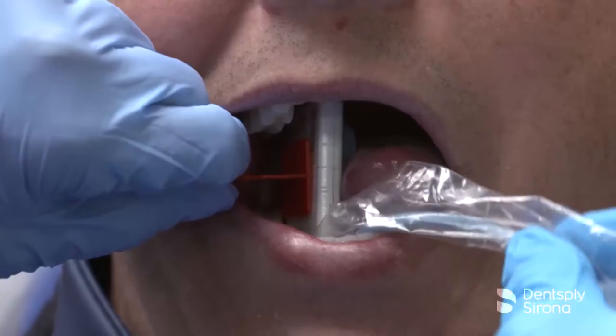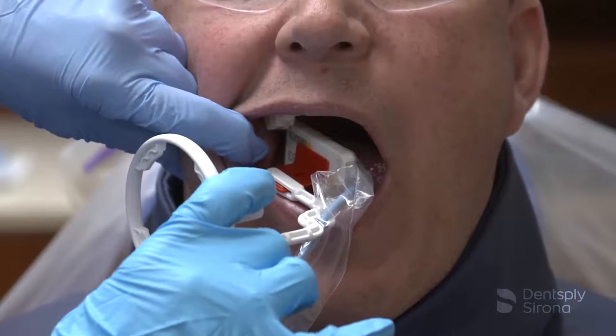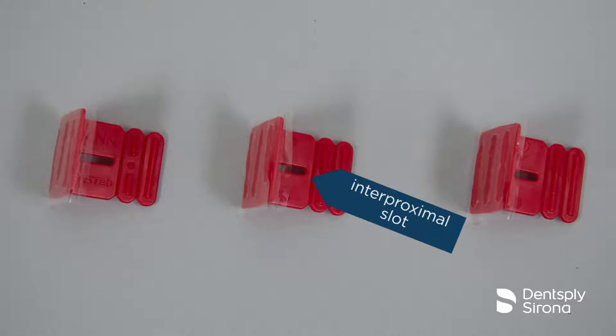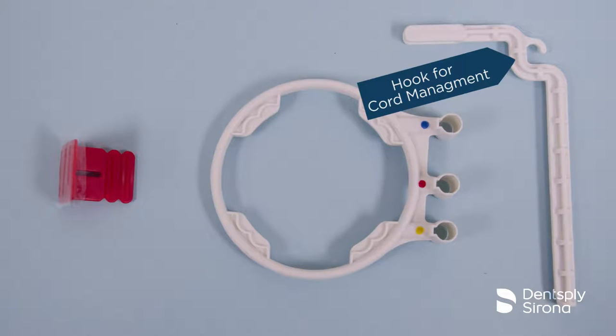To help the clinician aim for success, the FastTab bitewing holder has a permanent adhesive to keep the holder from moving or separating from the sensor during the procedure, is molded with an interproximal slot designed to help prevent overlap, and is available with an optional positioning arm and ring to accurately align the X-ray cone with the FastTab bitewing holder.